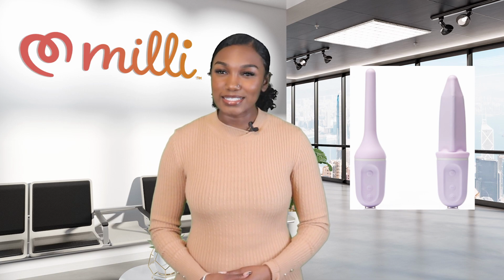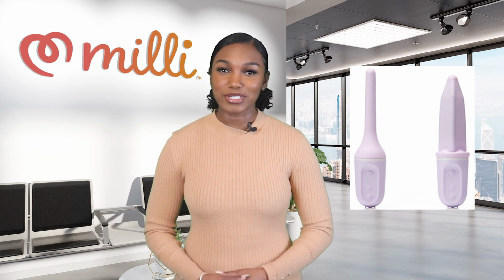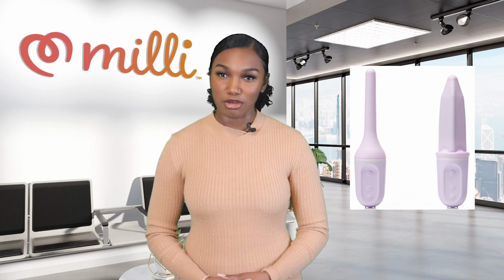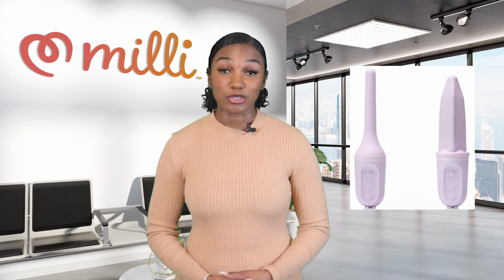Once the tightness is eased, the diameter may be increased another millimeter. If you experience pain, the diameter can be reduced by pressing the minus button. In general, you should try to work through mild discomfort as the tight muscles are being gently stretched, but to stop if there is pain.